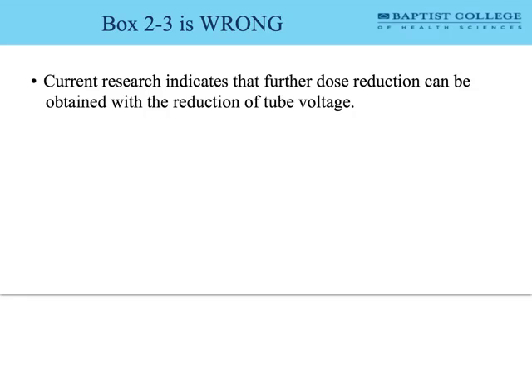CT is a little bit more complicated, is the short answer. It's using computers, it's using a huge array of software algorithms to do the image production that it does. And because of that, increasing of KVP does not necessarily mean a decreased patient dose in CT. It's true for X-ray, not true for CT.